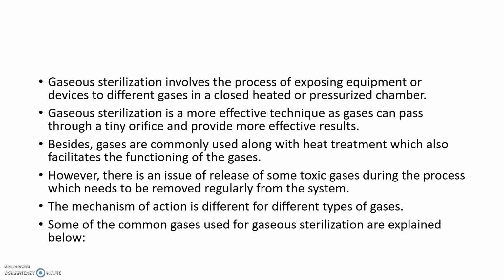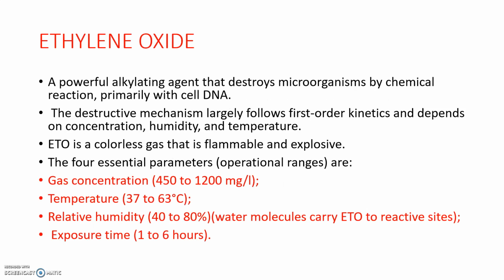However, there is an issue. What is the issue? That is the release of some toxic gases during the process, so they should be removed regularly from the system. The mechanism of action for each gas is different. Some of the common gases which are used in gaseous sterilization are given.